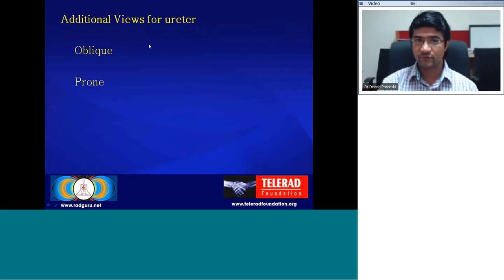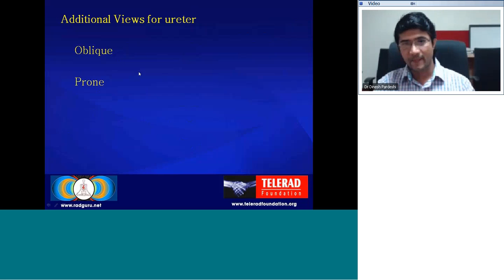There are additional views. I told you the oblique view and the prone view. Basically the oblique view is taken when we suspect calculi are there, where various calcifications are there. Whether these calcifications are in the course of the ureter or they are outside the course of the ureter, to delineate that, usually the oblique view is helpful. And the prone view, when we can't apply compression in the patient, in those patients the prone view helps us to delineate the distal ureter, which may not be evident normally. Making the patient prone will make the distal ureter dependent, and it will also allow the bowel gases to separate. So it helps to evaluate the course of the ureter.